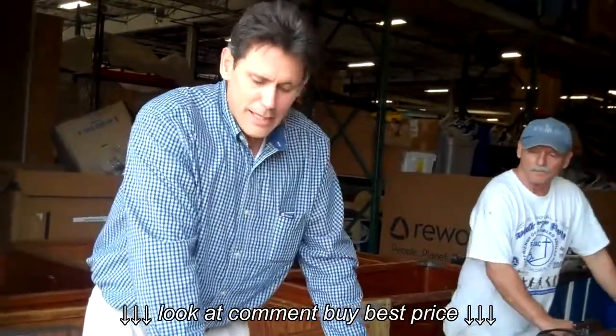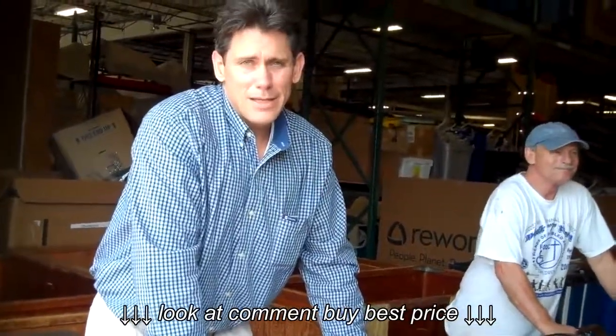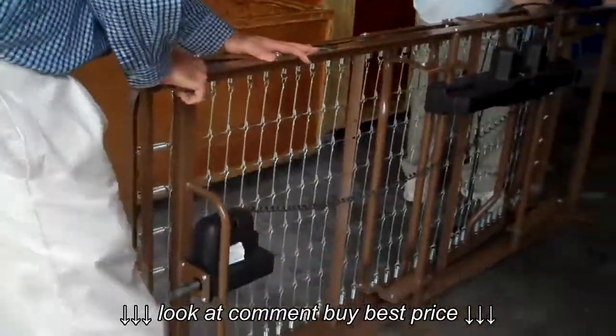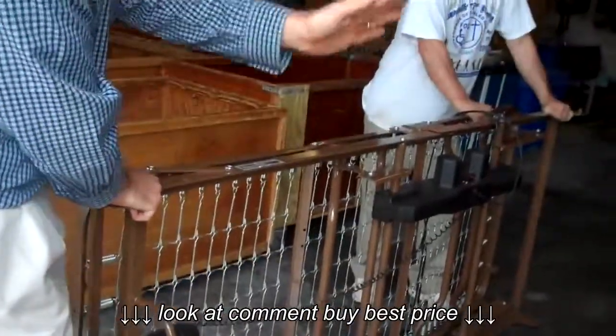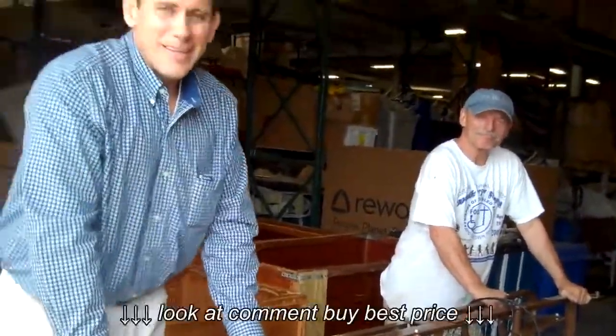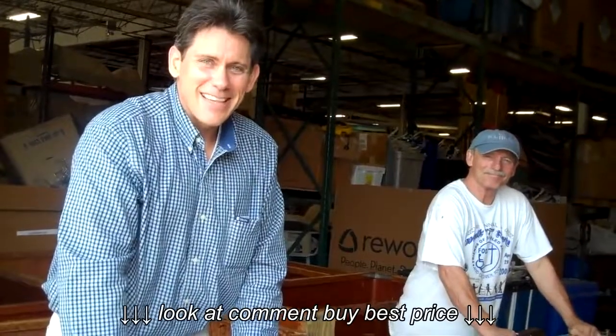So the process of setting up that bed is just the opposite of what we did here. We just put the headboard and footboard back on, put our foot on the wheel, and two people can tilt it back up straight. So that's our quick demonstration of home care beds today. Thank you so much.